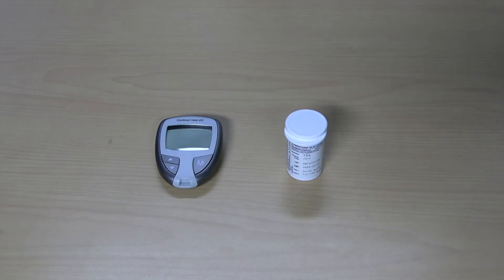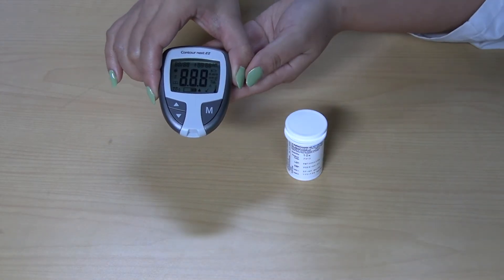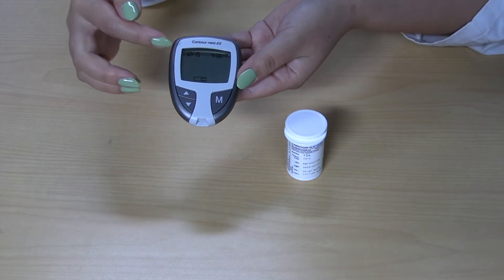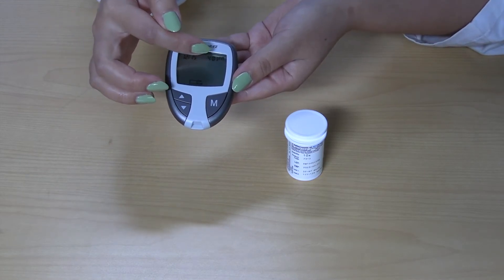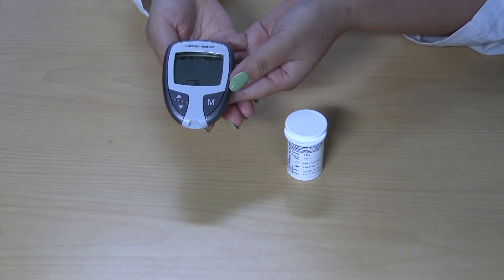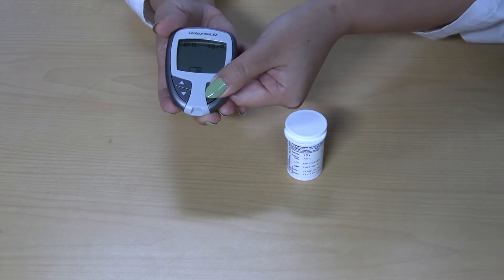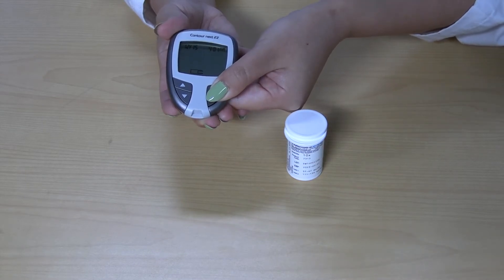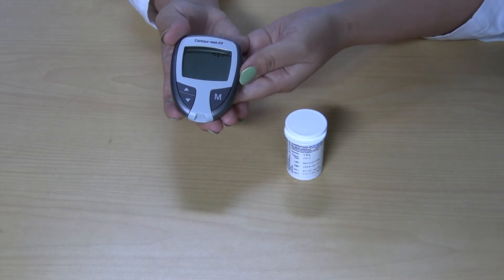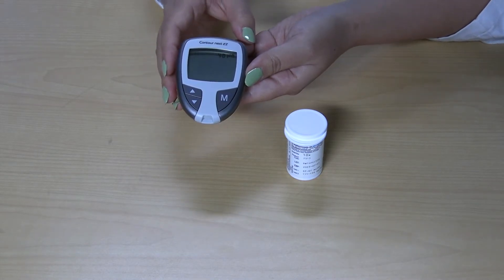When first using the meter, make sure the date and time of the blood glucose monitor is correct. This is to ensure that we have accurate data when tallying into the logbook. All meters have different settings for the time and date. On this meter, holding the M button will adjust date and time. The button on your meter may be different depending on the brand of your glucose monitor. Refer to the user manual for more instructions on your particular meter.